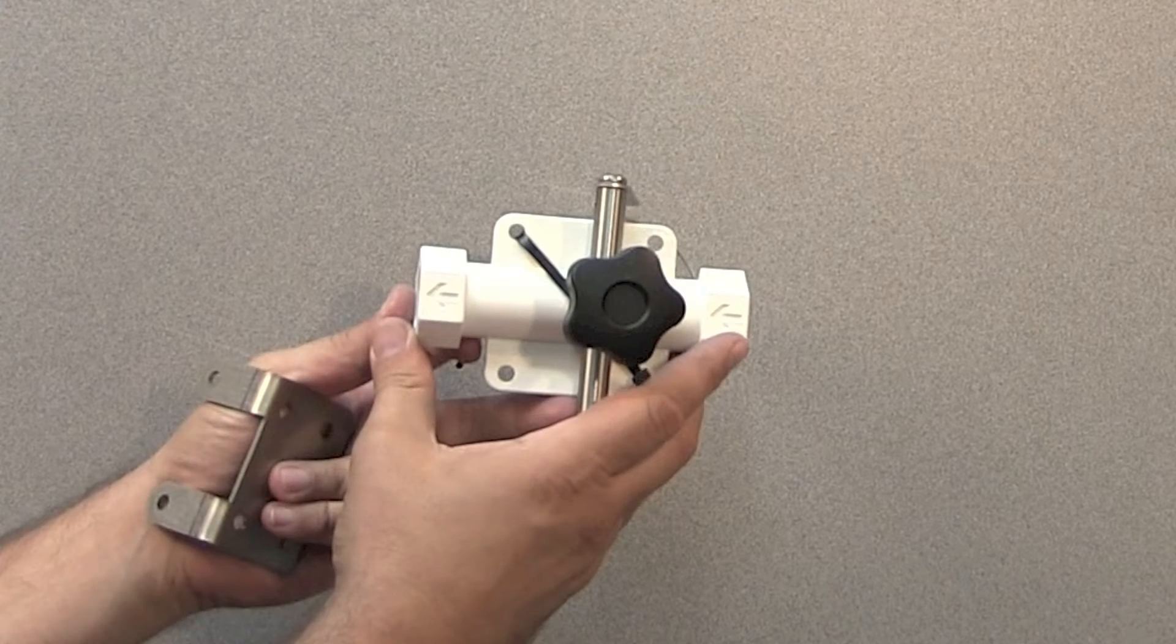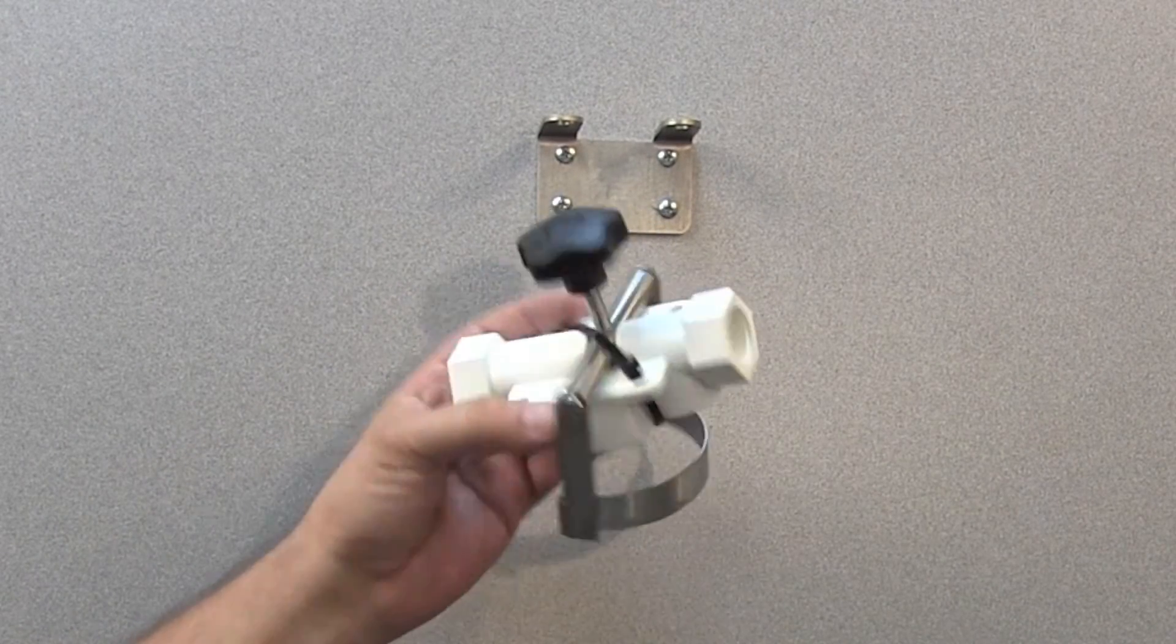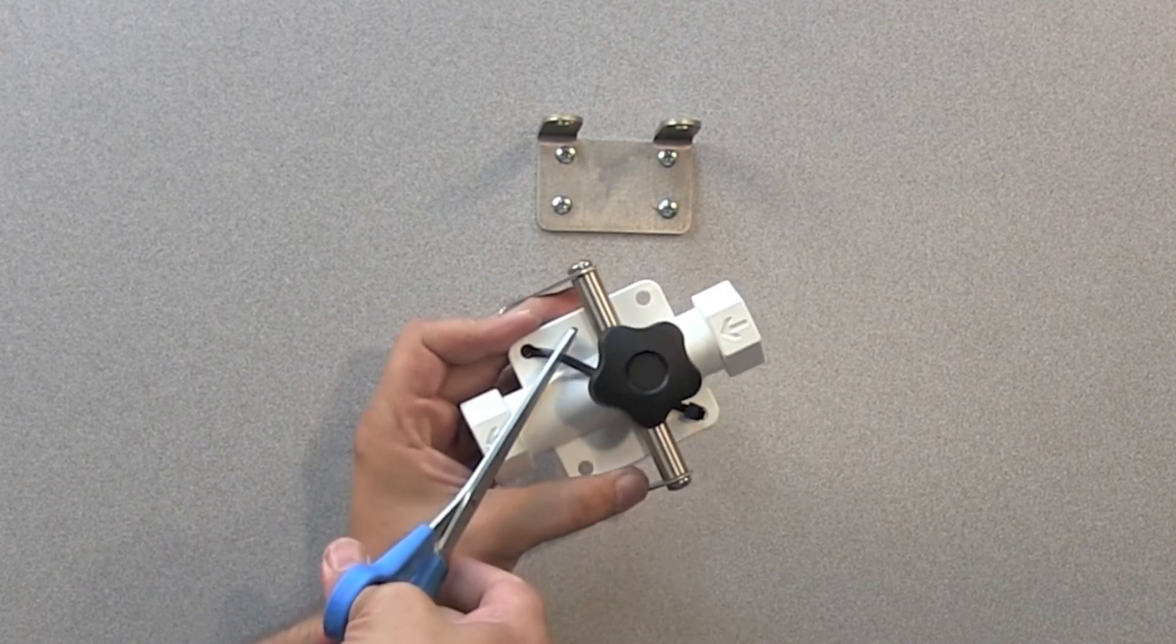The manifold assembly is shipped with a tie wrap around its body to keep the stainless steel filter retaining bracket in place. Cut the tie wrap and discard it.